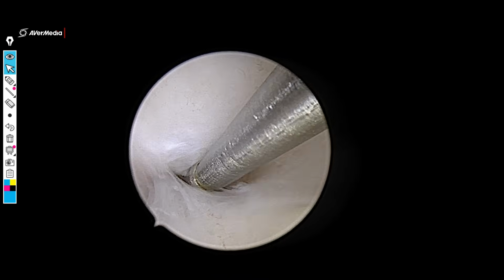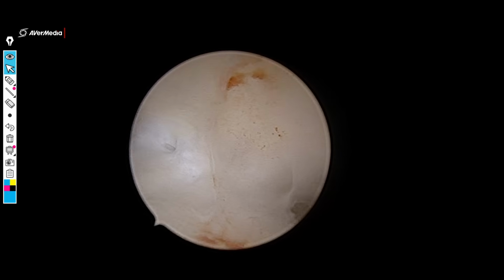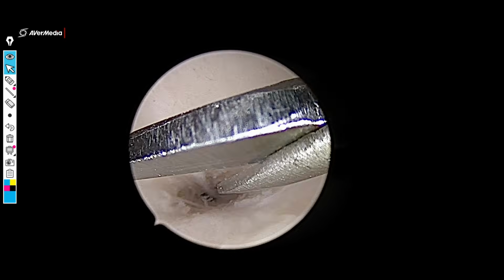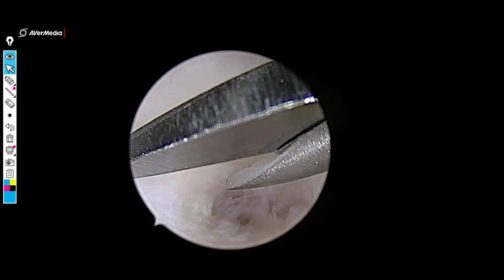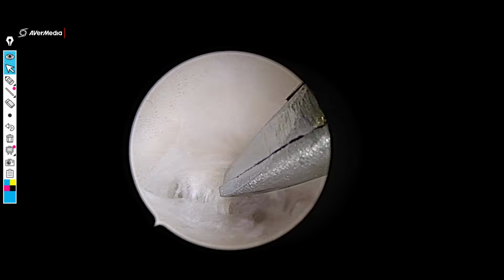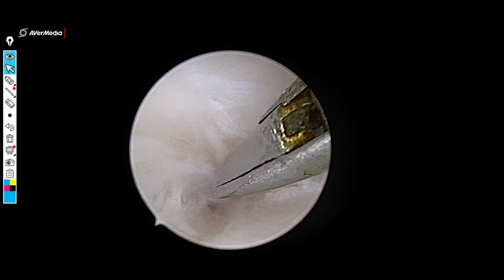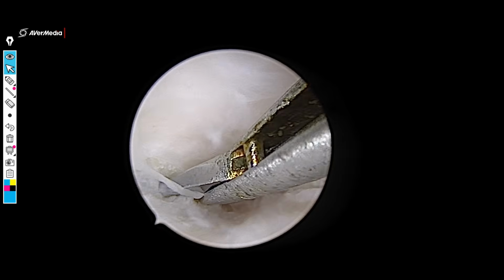Notice how fibrous these adhesion bands are, and the scissor going inside slowly and steadily because of the distending force of the saline. The scissor is able to open up the spaces inside the uterus and create more and more space compared to what was there before. Also, in the cutting of the scissor, you can see there is a very hard tissue which is being cut, because of which the scissor is finding some resistance.